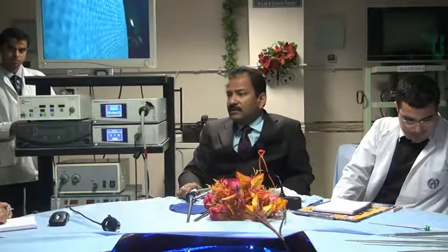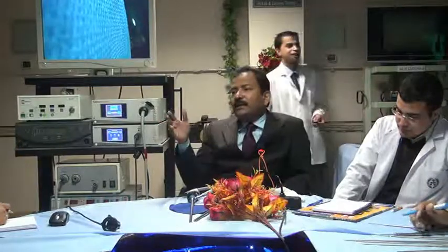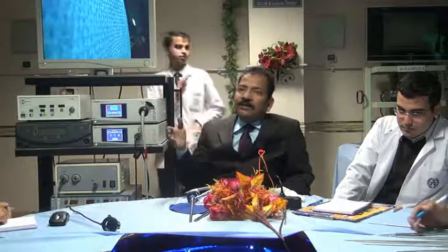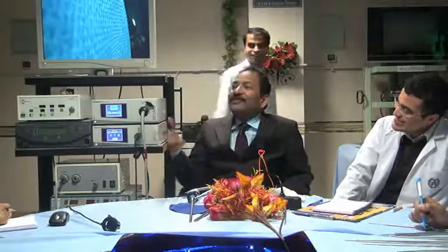So you said that the basic laparoscopic surgeries can be done by single chip cameras. So what kind of surgeries do require the 3-chip cameras? 3-chip camera, like suppose you want to perform colorectal procedures, bariatric surgery, fundoplication, major procedures, and it is not like that. It depends upon you. If you have a Lamborghini, you can use it to go to your toilet also. It is up to you, because it depends upon how sophisticated you are.